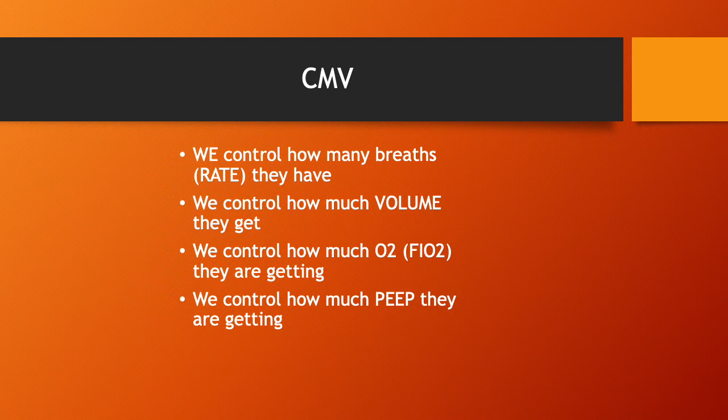Just understand, for this mode, this is a completely controlled mode. We are controlling everything, and we're saying you have to at least do this. You have to have this much oxygen, but we are completely in control, and we are pretty much setting them up like, hey, this is what you need to do.